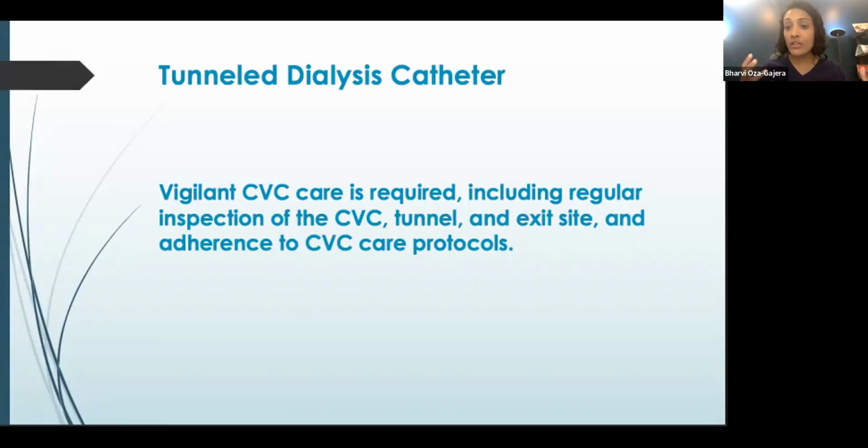Sometimes it's not necessarily infected, but the tape is having a reaction to the skin. So you want to take a look at all of that. Then you look at the exit site itself, where the catheter actually comes out of the skin.